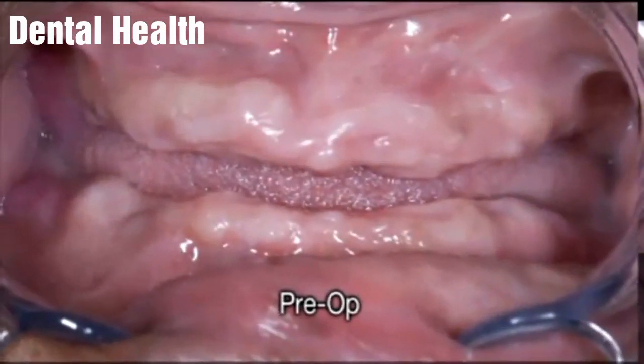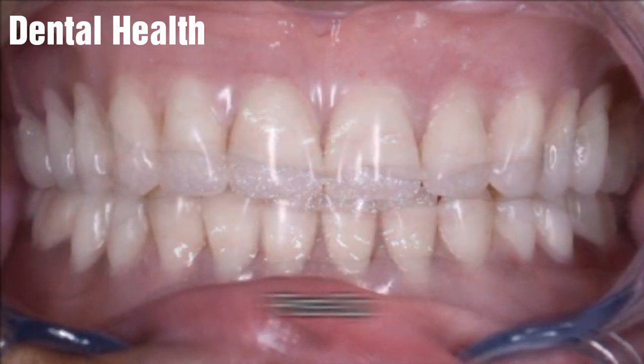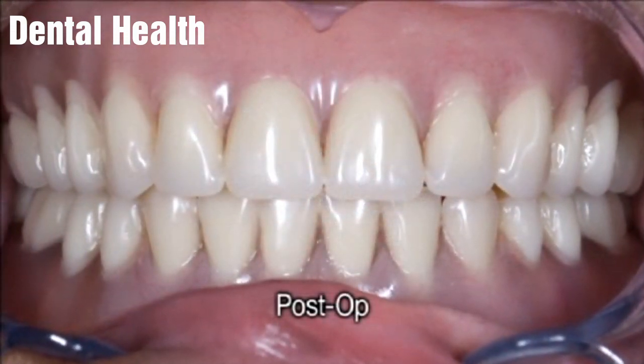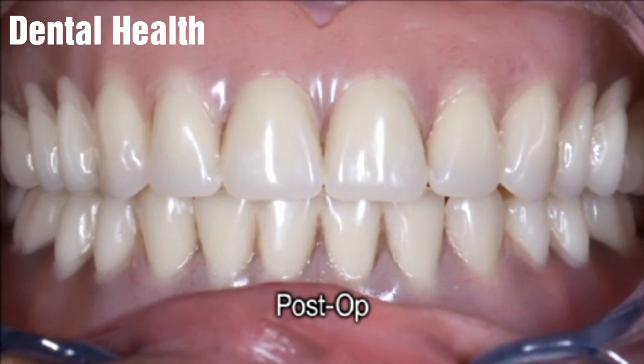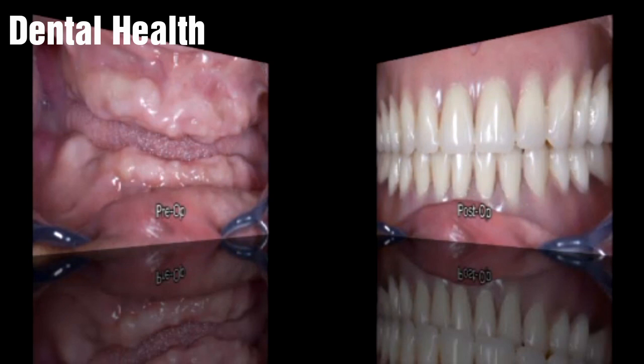The good news is that you have options to replace them. Dentures can help restore your way of life by helping you with day-to-day functions, such as eating and speaking, as well as help restore your confidence by improving your appearance and smile.